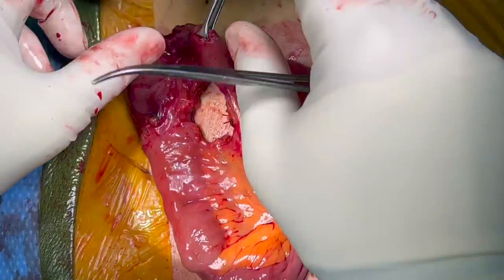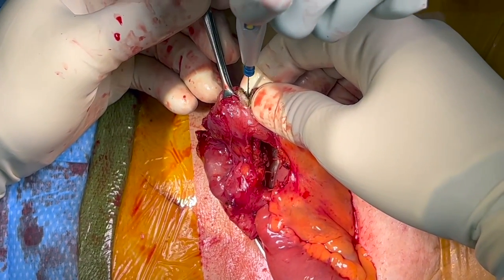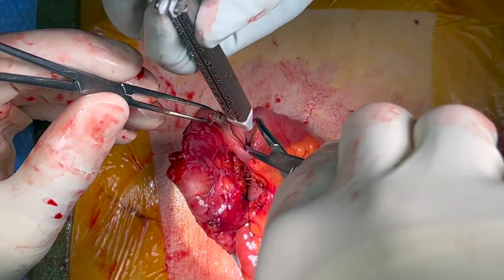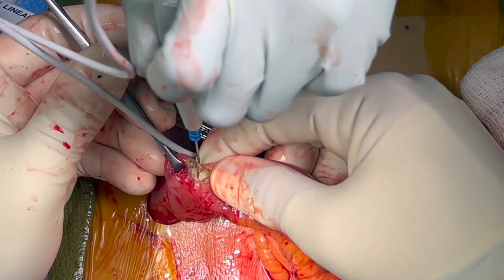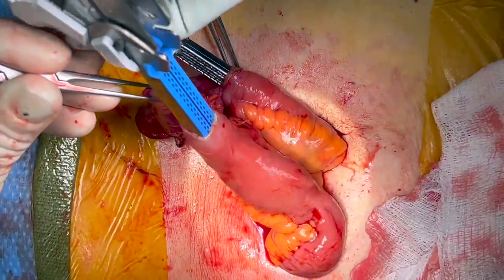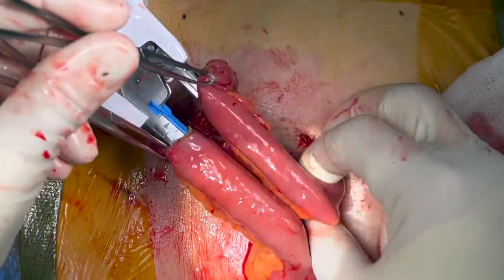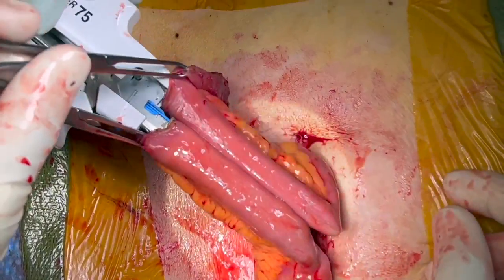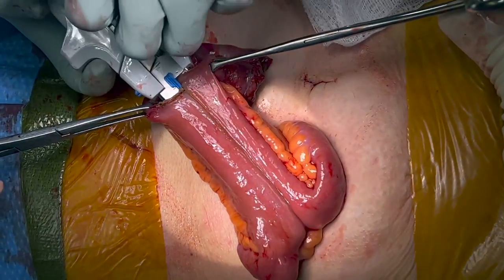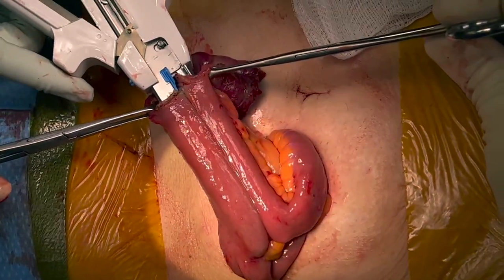For a stapled side-to-side anastomosis, the anti-mesenteric side of each ileal end is cut. A 75mm gastrointestinal stapler is used to create the anastomosis. Care is taken to ensure the limbs are opposed along the anti-mesenteric surfaces prior to firing the linear stapler. The stapler is fired and removed, and Allis clamps are used to align the common enterotomy with the linear staple lines offset.